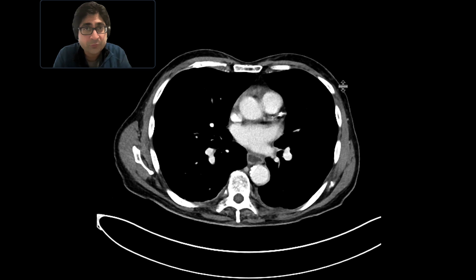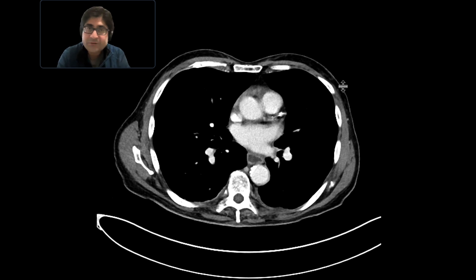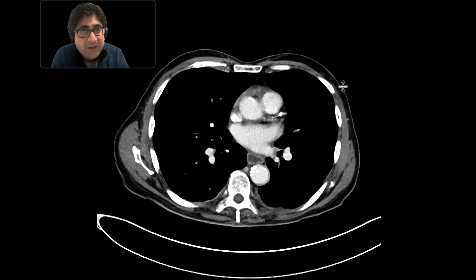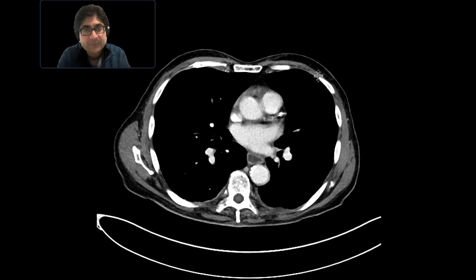This is a patient who presents with right upper quadrant pain, got an ultrasound that showed some findings, and they wanted a CT to further evaluate it.